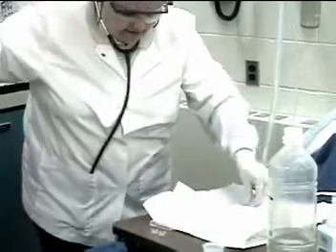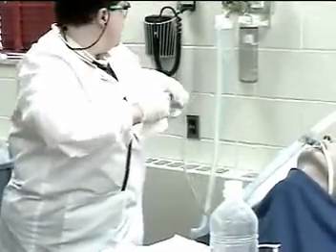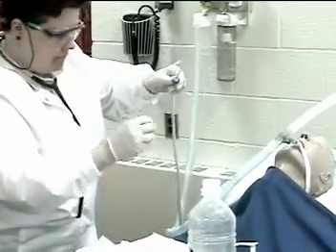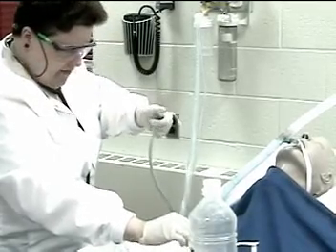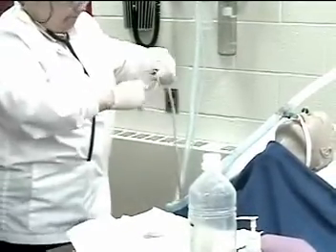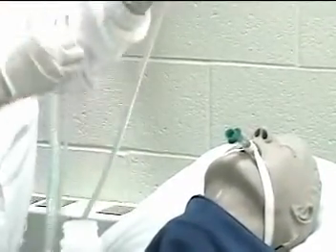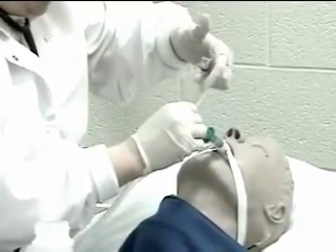I'm going to get the saline and the suction adapter. No water is coming up the suction catheter, so I'm just going to lubricate it a little bit. Are you ready? Disconnect the patient and insert the catheter. Here I go.